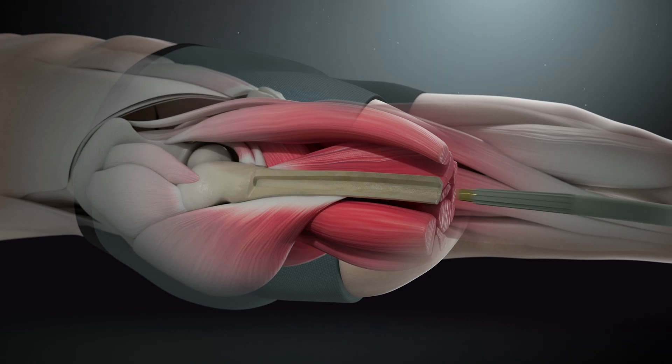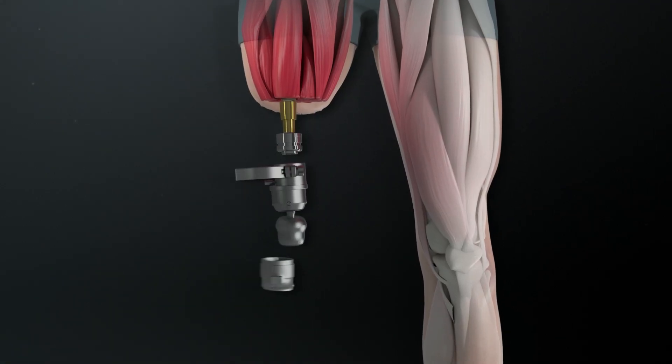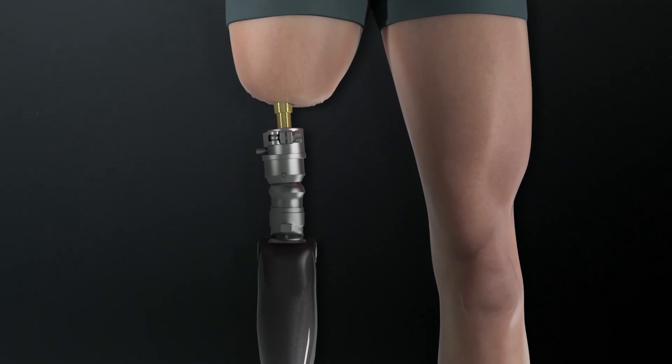The implant then passes through a small opening in the skin at the end of your residual limb. This is called the stoma, and then via a connector it attaches to your prosthetic limb. Originally it was more commonly used for above knee amputations because they were more prone to facing challenges with a socket prosthesis.